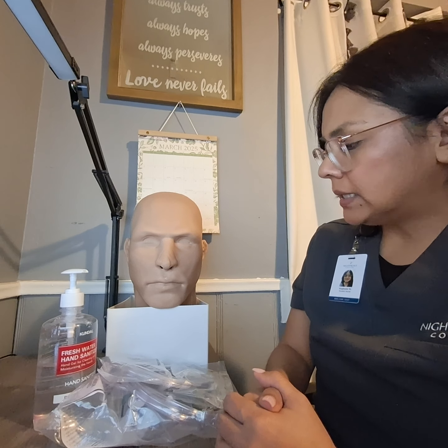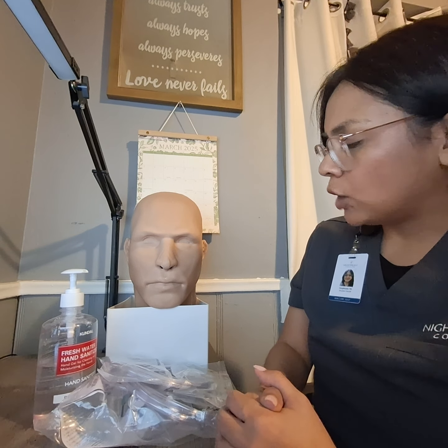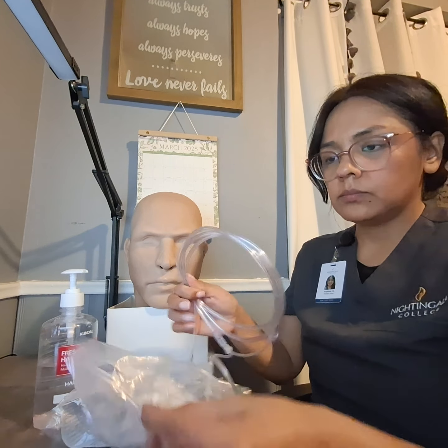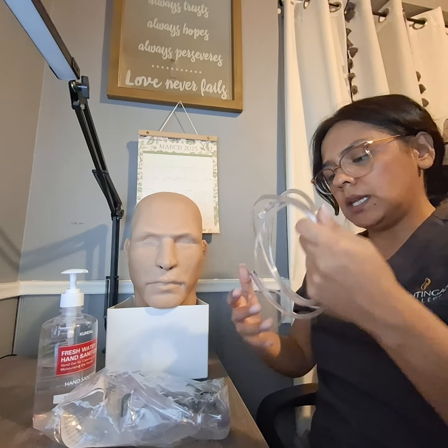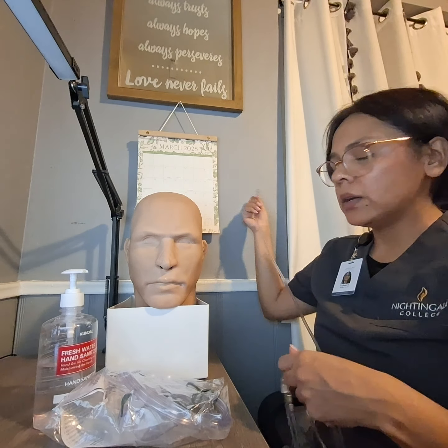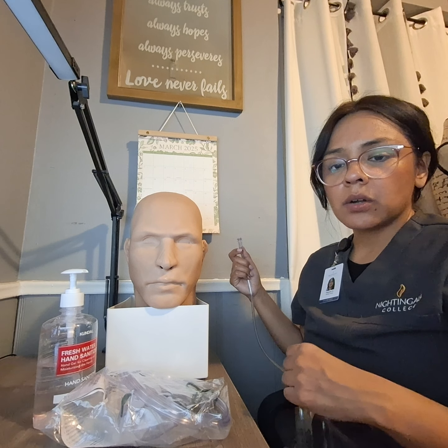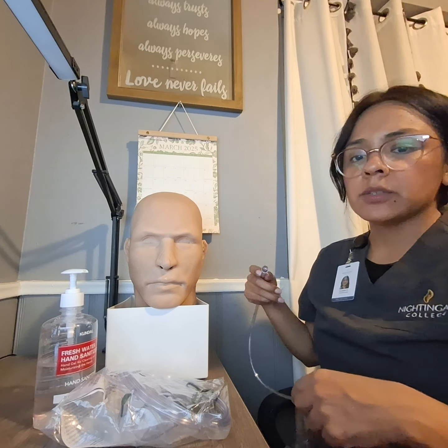So your oxygen is a little low today. Your doctor has prescribed a nasal cannula to help you breathe better. I will take the nasal cannula from the wrapping, throw that away. I will take the nasal cannula tubing, plug it into the oxygen flow meter here on the wall, and normally that should be between 1 to 6 liters per minute. The doctor has prescribed an order to set the rate at 3 liters per minute.